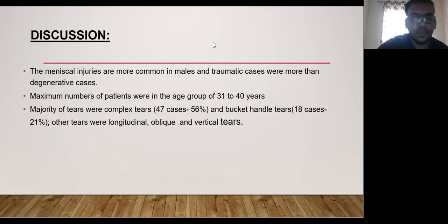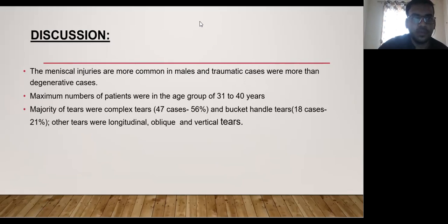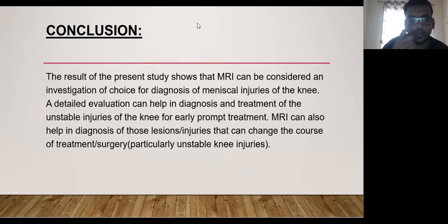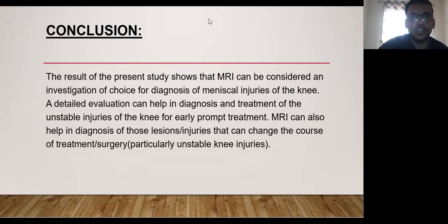In discussion, meniscal injuries were slightly more common in males, and traumatic cases were more common than degenerative ones. The maximum number of patients were in the age group of 31 to 40 years. The majority of tears found were complex tears, with bucket handle tears as the second most common, followed by longitudinal, oblique, and vertical tears. In conclusion, MRI plays a crucial role and is the investigation of choice for diagnosing meniscal injuries of the knee. Detailed MRI evaluation enables early diagnosis and treatment, especially for unstable injuries requiring prompt management, and can identify associated injuries that may change the course of treatment in young patients.